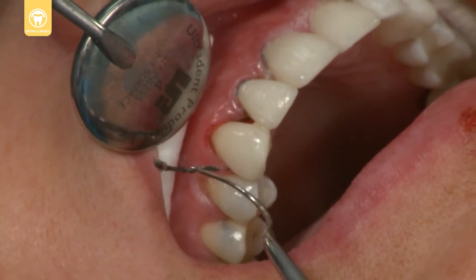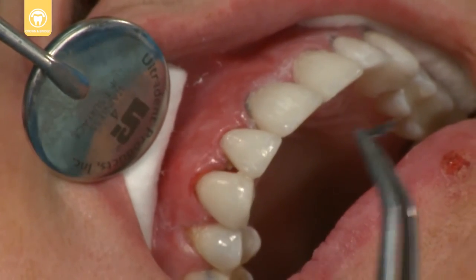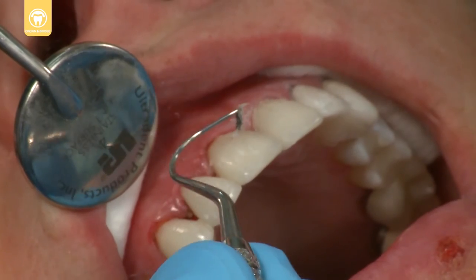Finally, remove the UltraPack knitted cord, remove excess flash, finish and polish the margins, then rinse and dry.